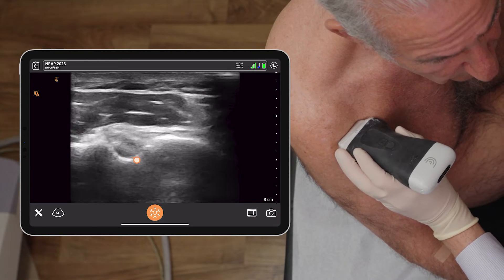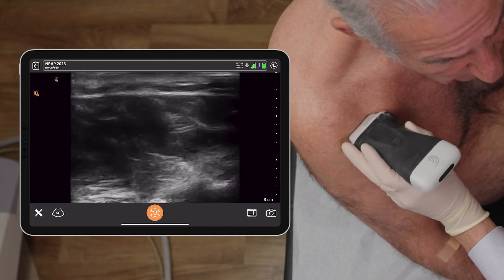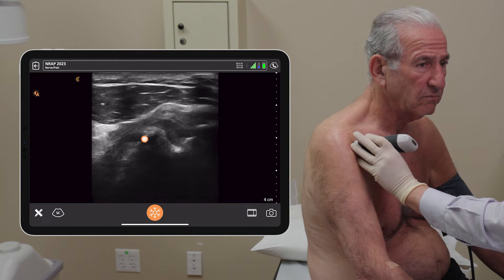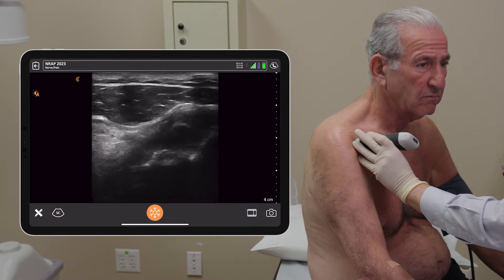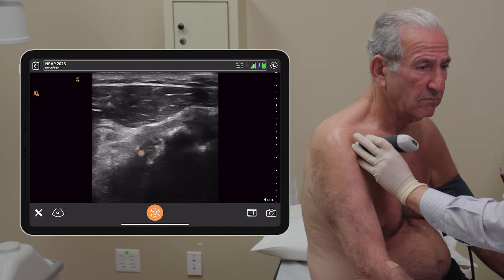Here's his biceps groove, the biceps tendon, and subscapularis is overlying it. I'm just going to scan medially, increase depth, and the cartilage around the shoulder joint is darker — right there. We're medial to the humerus.